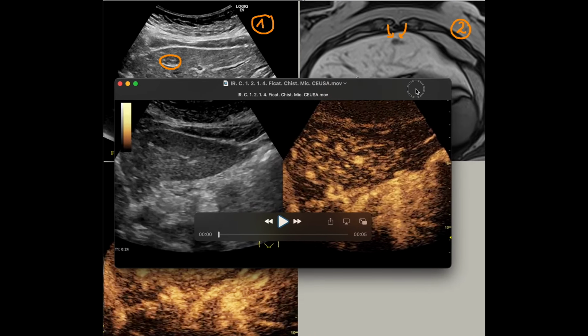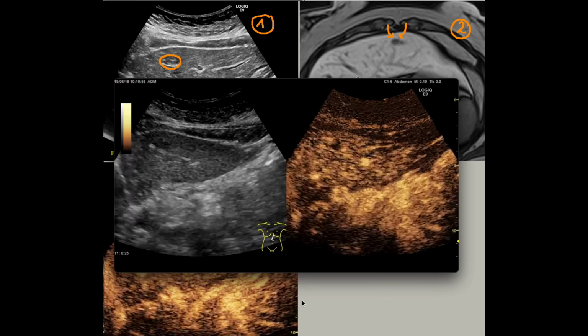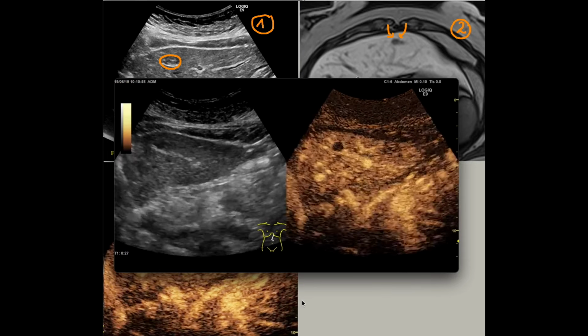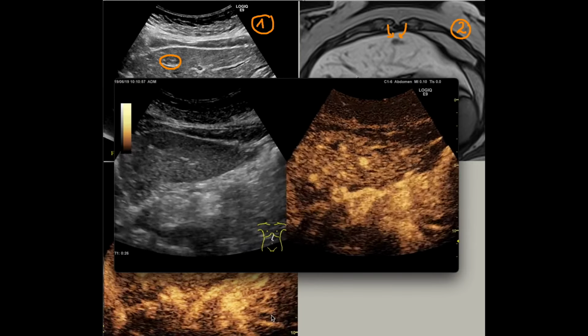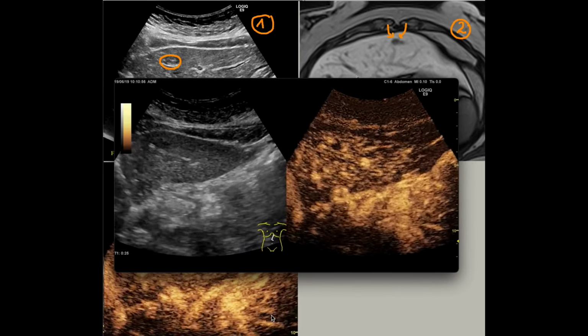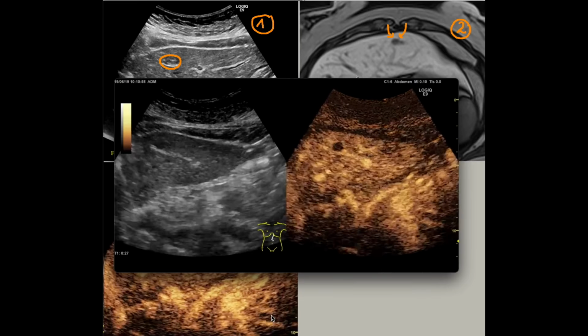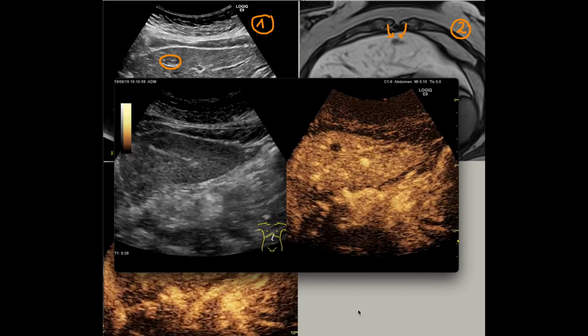The image we see here is the image in harmonic mode. It is the examination during arterial time. You can see the tumor formation on this image loop. It is the end of arterial time. We're at the 24th, 25th second, and we can see the appearance of the formation that was also seen on the frozen images. So, appearance of a simple sub-centimeter liver cyst with elements of avascular condensation.